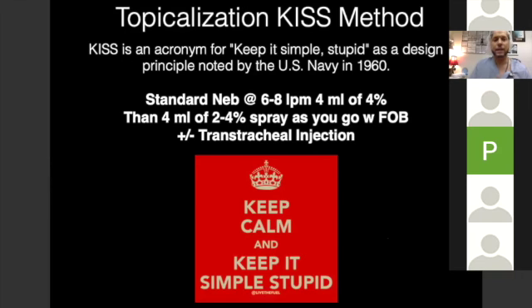All right, now let's get into our technique for the awake fiberoptic intubation. We have the KISS method. KISS is an acronym for Keep It Simple, Stupid, a design principle noted by the US Navy in the 60s. If you have a technique with multiple different applications of topicalization, it's going to get time consuming, tricky and complicated. So let's keep it simple.